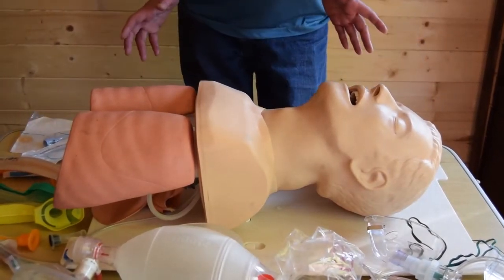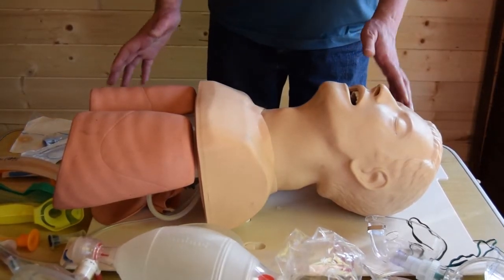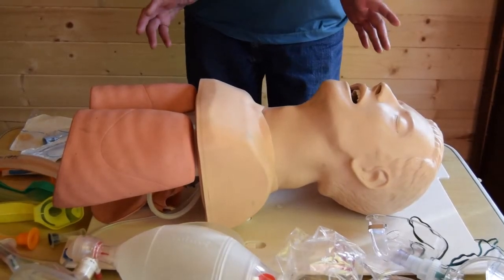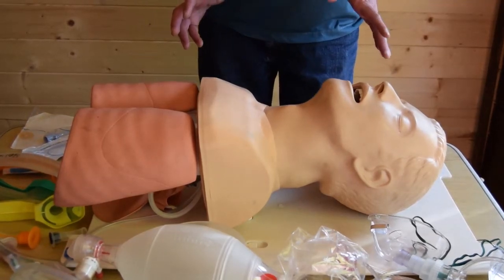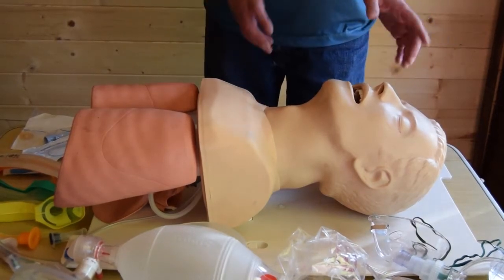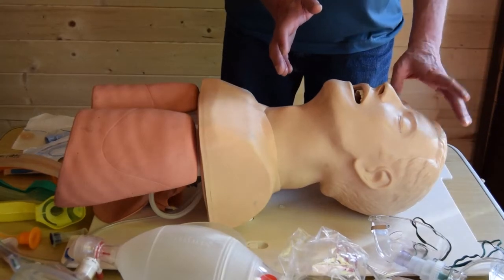So today we're going to look at some airway management, and I have Bill here who's our subject for today. What we're going to do is go through a stepwise approach for airway management. Our first concern is to check whether the patient has an airway, and we could have a quick look in the mouth to make sure that is clear, and then normally in order to open the airway we would use the head tilt chin lift method.